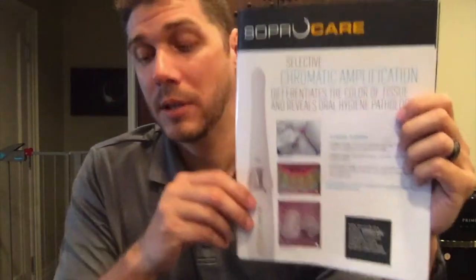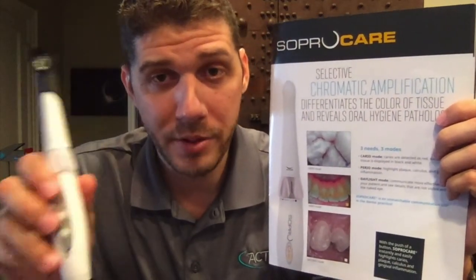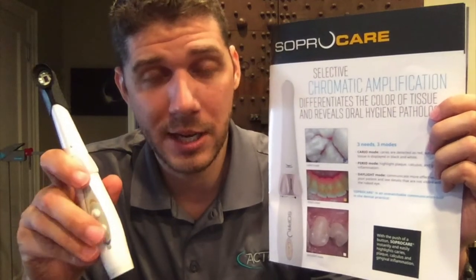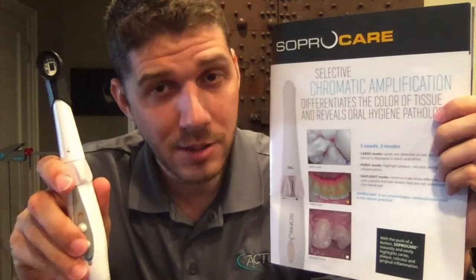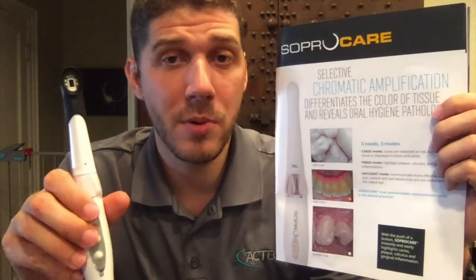The SOPRO Care camera — the white one — is great in a hygienist's hands. Both the SOPRO Life and SOPRO Care have caries detection, but the SOPRO Care, instead of two levels of caries detection, has one level plus a perio mode. A hygienist will use the caries detection to help identify caries and present them to the doctor, but they'll definitely also use the perio mode, which is where this camera really shines and is unlike any other camera on the market.